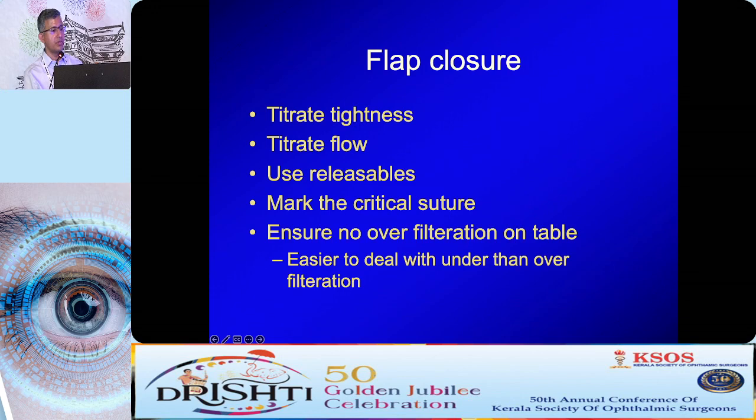With the flap closure, you need to titrate the tightness, you need to titrate the flow, and you need to be able to do something with it post-op, which is why it's best to use releasable sutures. You need to mark the critical suture. The critical suture is, when you're doing the suturing, where did it flow from the most? Was it the nasal side or the temporal side?